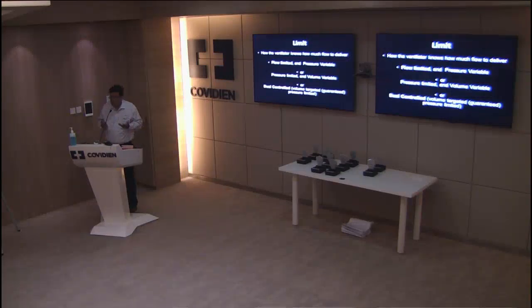Sometimes you have modes which take advantage of both, which is sort of the best of both worlds. There could be a pressure controlled mode, but the volume is the one that is set. They're called dual modes, where you combine pressure and volume. We'll talk about that in a little more detail.